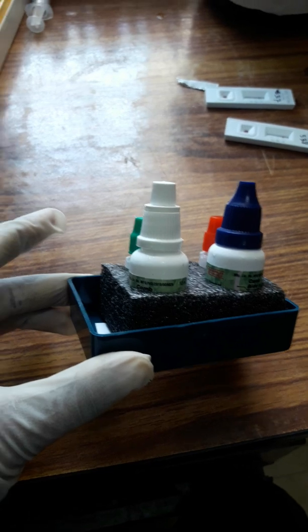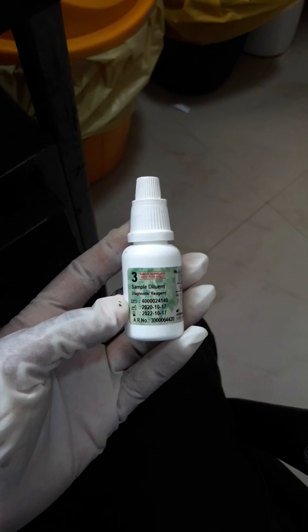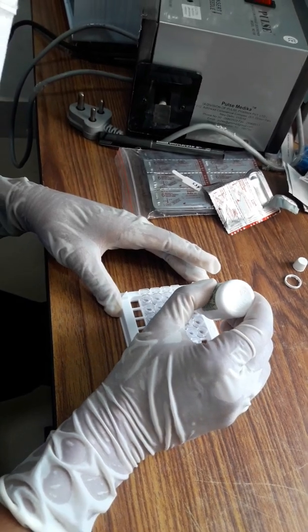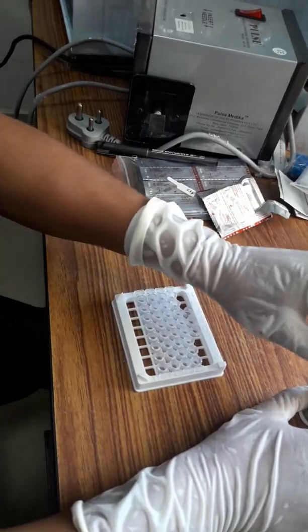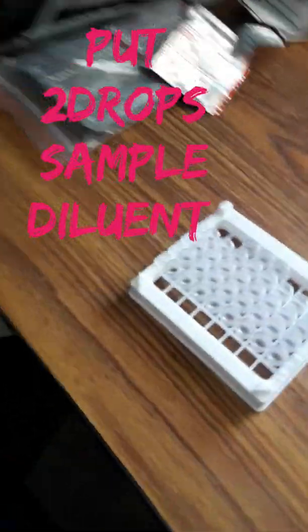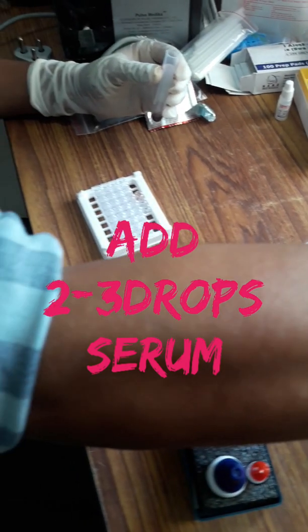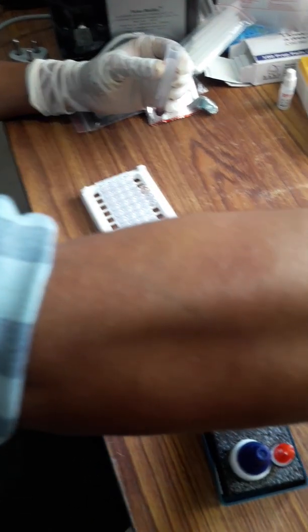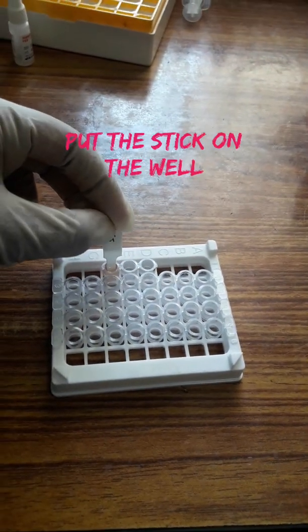Now you can see two reagents: number one, the sample diluent reagent, and number two, the signal reagent. Put two drops of sample diluent reagent into the well. Now add two to three drops of serum onto the well and shake properly.